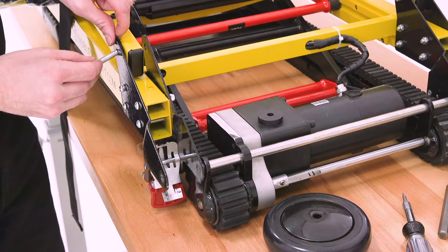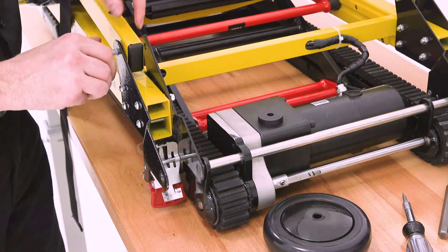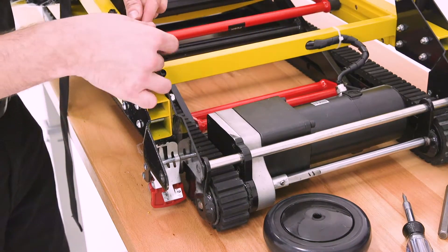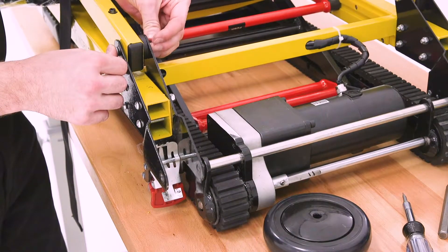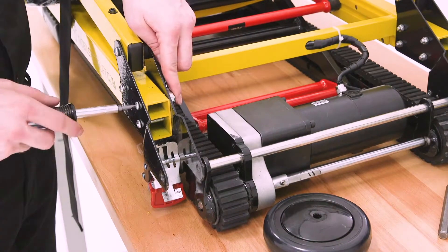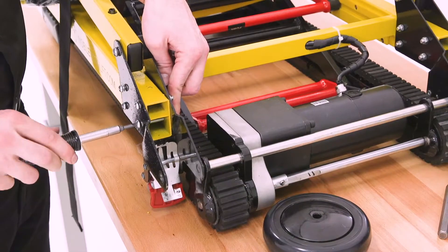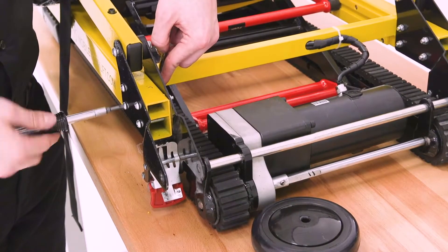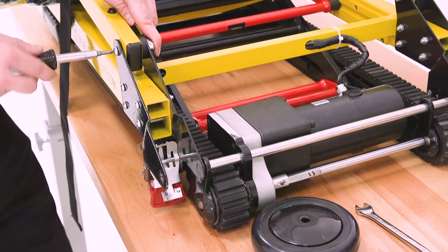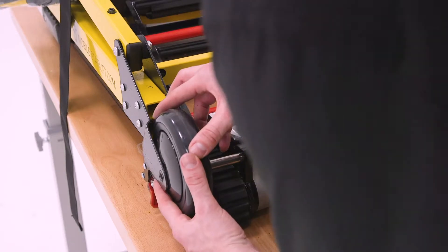When inserting the larger bolt, the thinner rubber washer must go in between the bracket and the outside of the lever, and the thicker rubber washer must go between the bracket and the inside of the lever. Next, tighten the smaller bolts by bracing the nuts with the 10mm wrench and using the screwdriver to rotate the bolts clockwise. To tighten the larger bolt, use the 13mm wrench to brace the nut and rotate the bolt clockwise with the screwdriver.